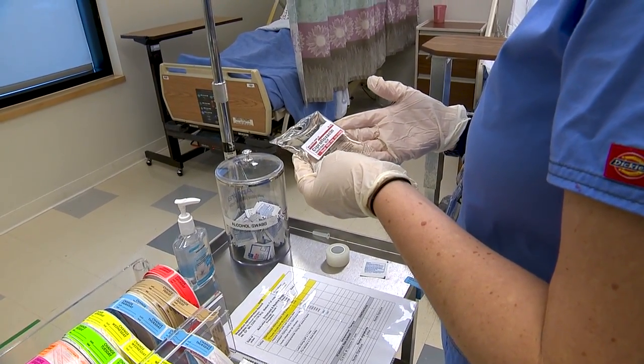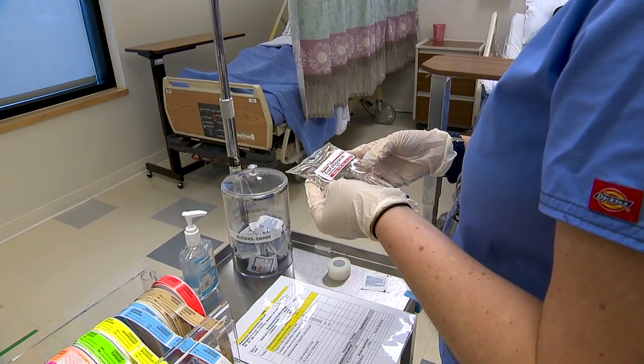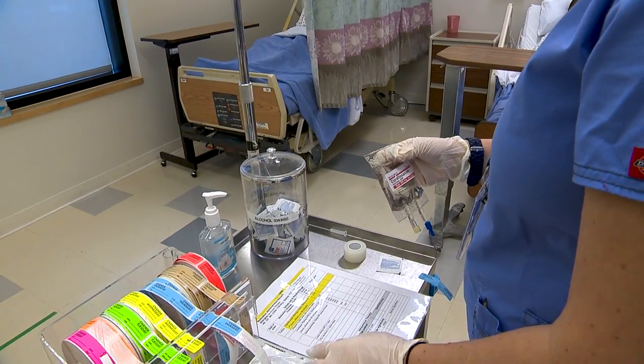It's clear. It's not cloudy. There's no discoloration. It looks like it was prepared today. The expiration date is good, 1/10/50. So now I can prepare my medication.